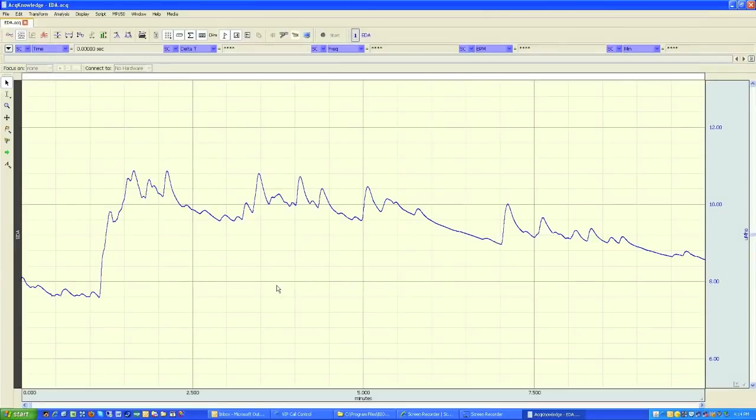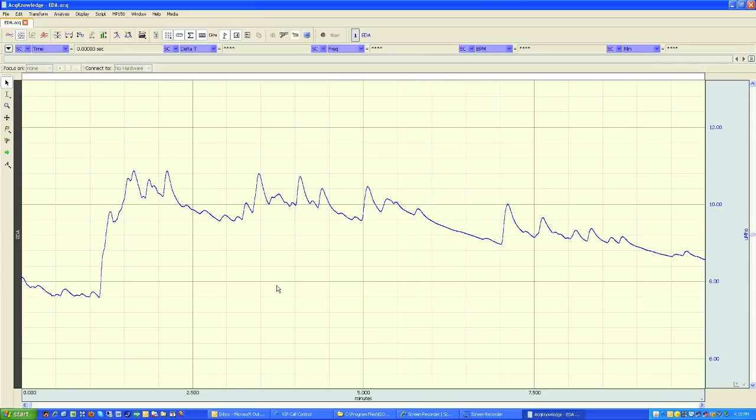The following screencast will provide you with a demonstration of the Acknowledge replay mode. The replay mode will allow you to replay any file just as if you were recording it for the first time.